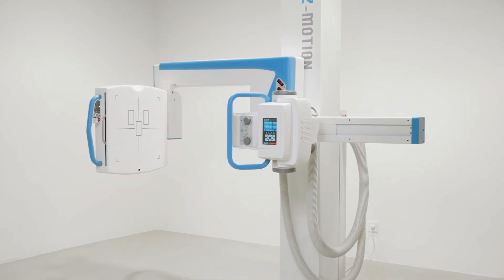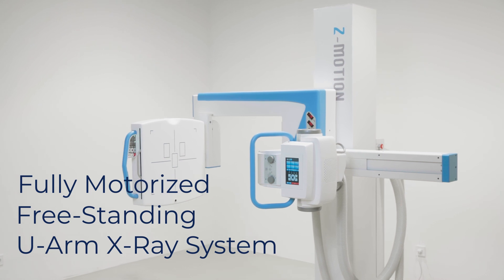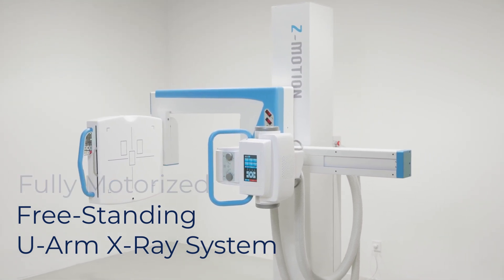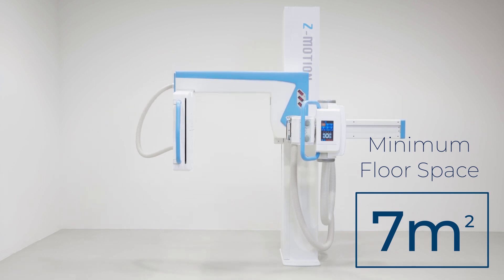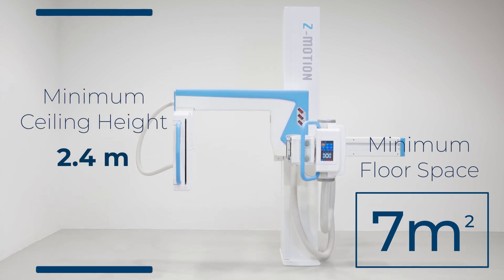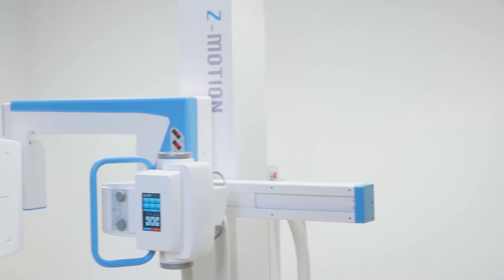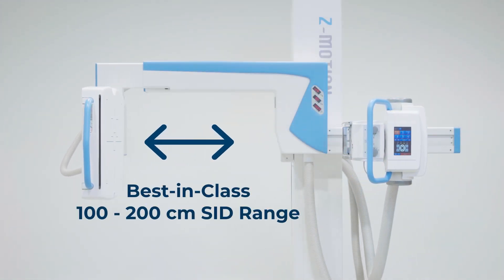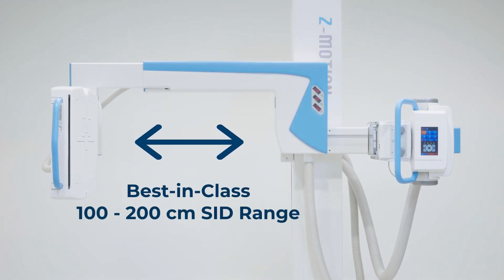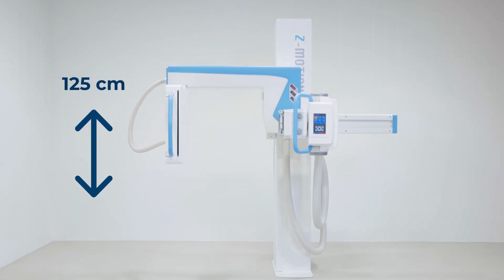The Z-Motion is a fully motorized freestanding single detector general-purpose radiographic system. With a recommended floor space requirement of 7 square meters and a minimum ceiling height of 2.4 meters, the stand can fit even into the smallest examination room. It features a best-in-class 100 to 200 centimeter source image distance range, and its vertical movement range is 125 centimeters.